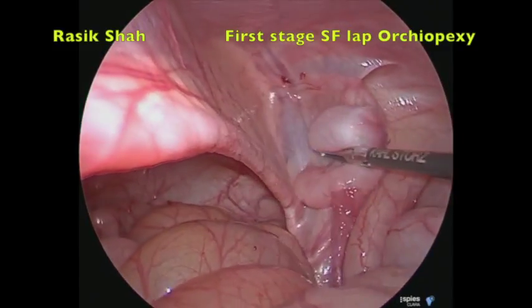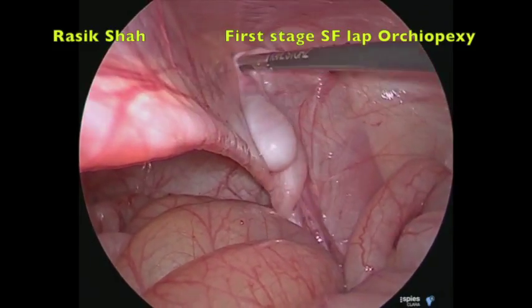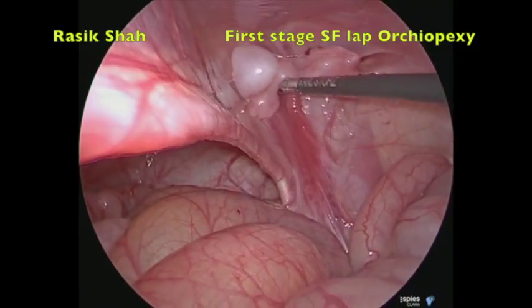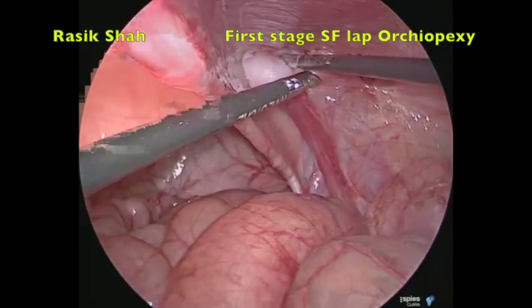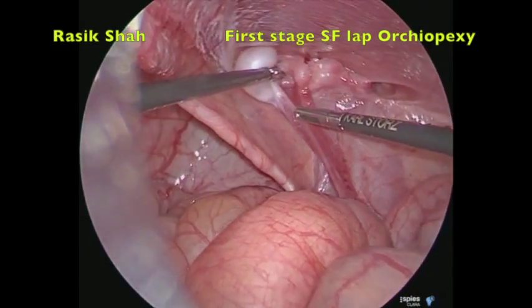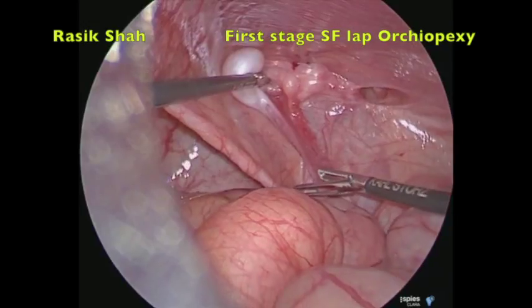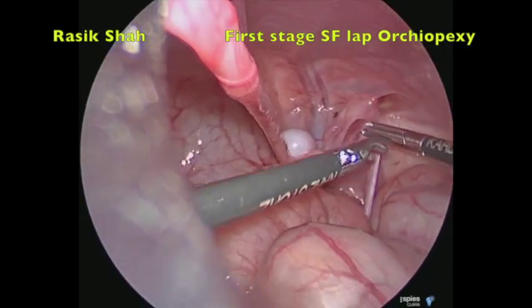Now we need to decide where we will divide the testicular vessels. The ideal site is anywhere 1.5 to 2 cm above the testes. We have to keep this distance for the development of collaterals between the deferential vessels and the testicular vessels. We are now measuring roughly the distance over the testicular vessels — approximately 2 to 2.5 cm from the testes — and we will be dividing the vessels there after controlling them.